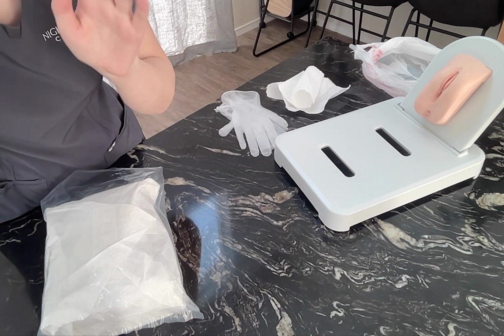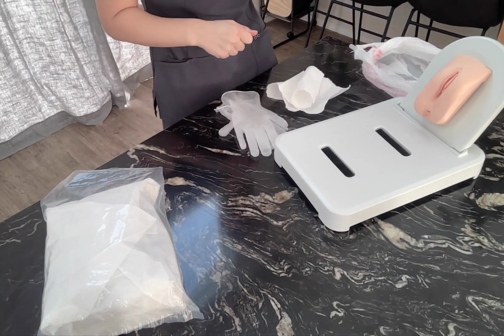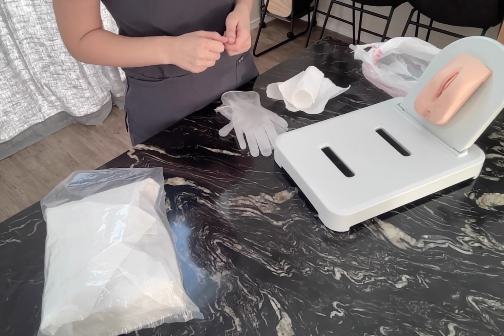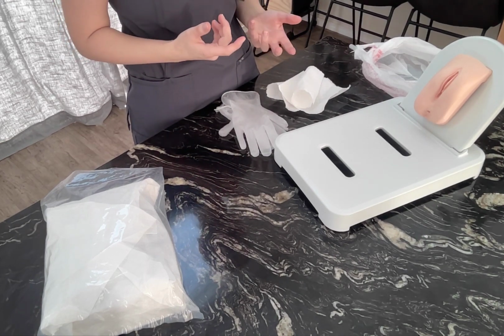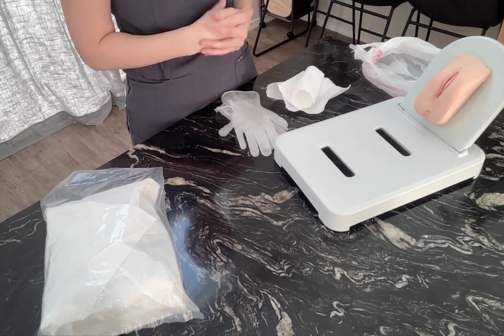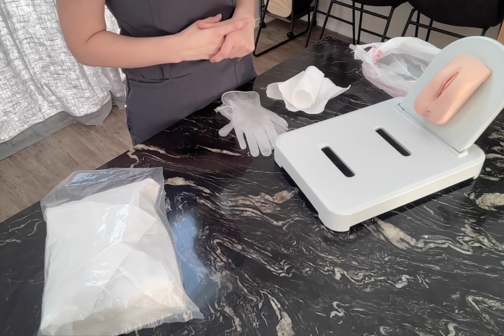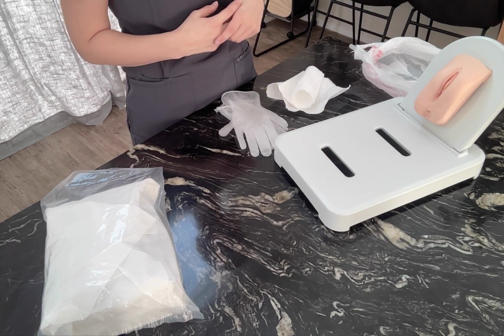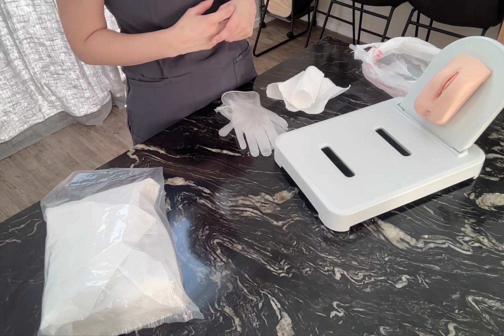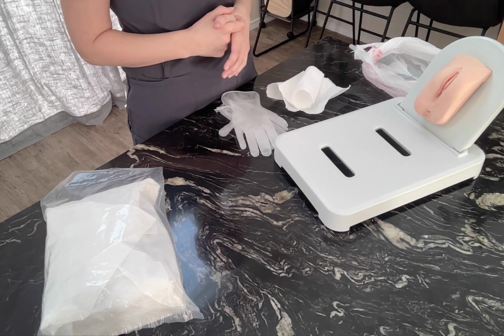All right, perfect. So to begin, I would go into the patient's room, close the curtain for patient privacy. I would ask Mrs. Smith to go ahead and verify her name and date of birth. Mrs. Smith, can you please verify your name and date of birth? Awesome. So today we're going to go ahead and do a Foley catheter insertion. That's what the provider has ordered. Are you familiar with this procedure, or do you need me to explain it in depth? No, you're familiar with it?